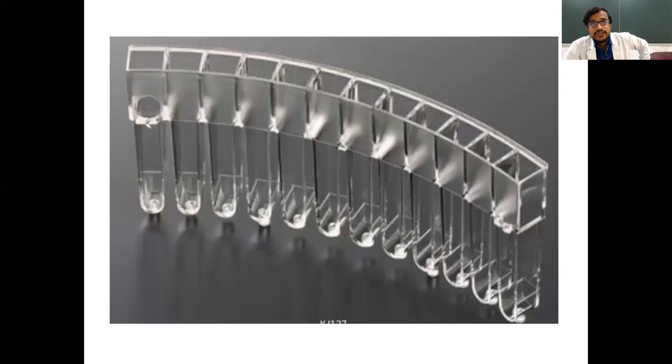But the disadvantage of fully auto analyzer is it takes a little more maintenance and it is not cost effective. All the reagents are a little bit costly.